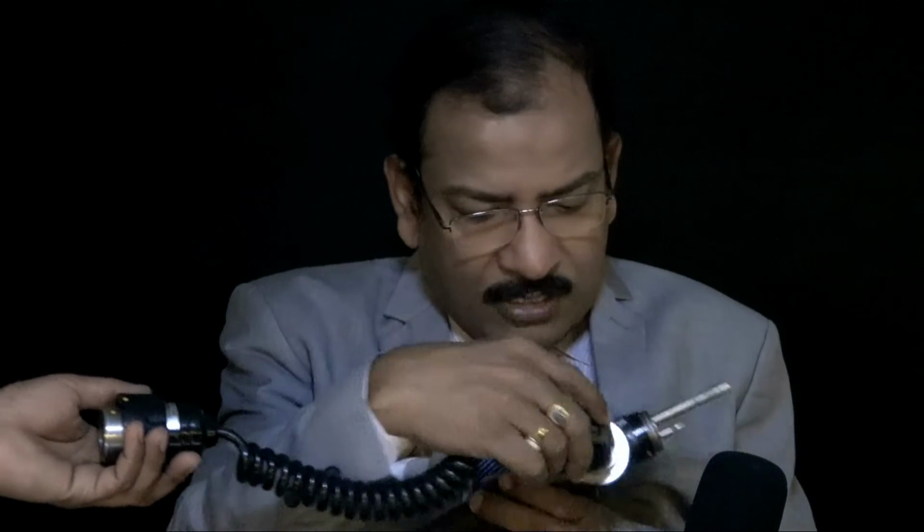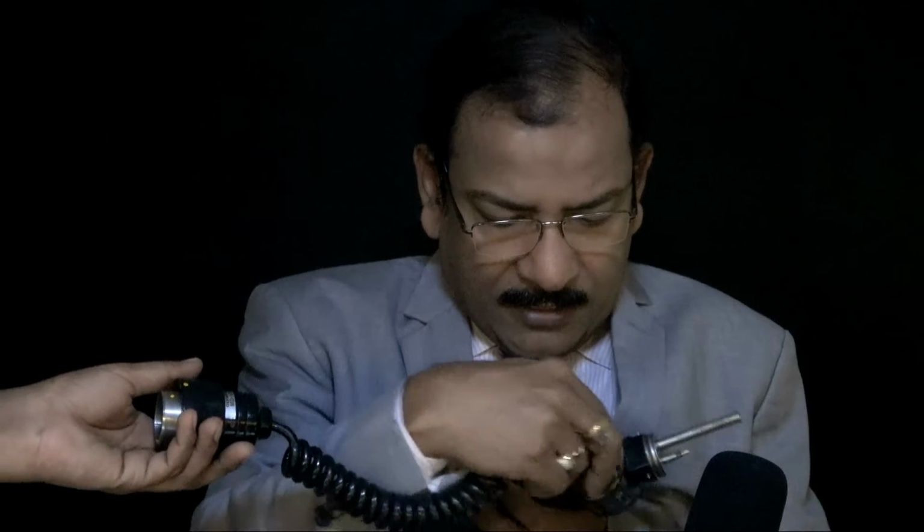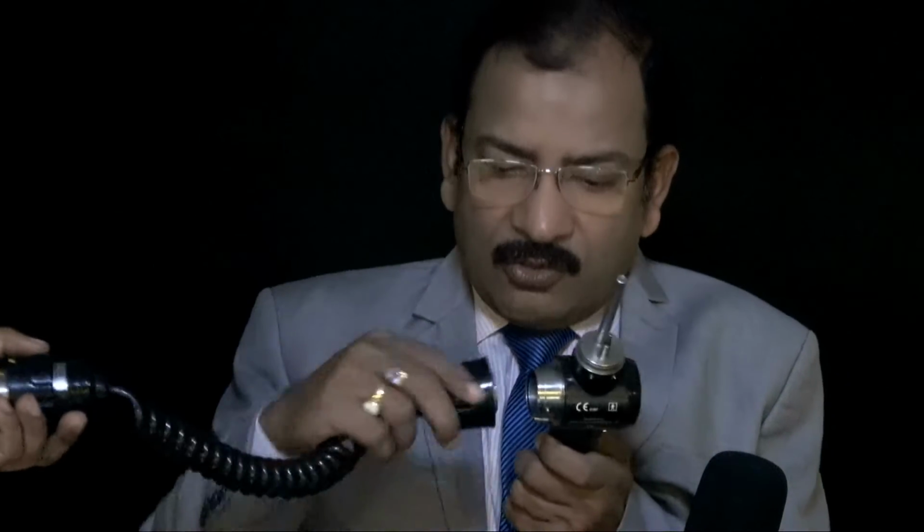There is a yellow point here, and there is one yellow point on this. So both the yellow points should be together. Here you will go, it is attached, and now you rotate it clockwise. It is done, and to remove it, rotate anti-clockwise and it comes out. You should not try to force it like that. It will break the teeth. Inside there are 20 pins, they will break. So align this yellow point of the male part with the yellow point of the female part of the pigtail adapter, and then rotate clockwise, it is fit.